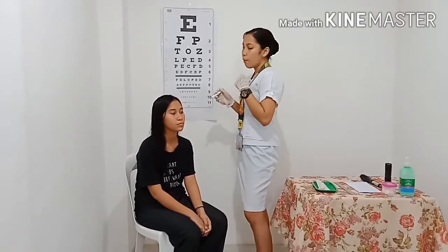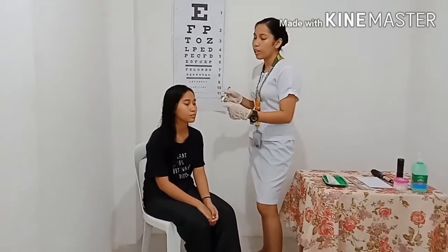The light should pass through the iris and the pupil, and there should be no shadow reflecting from the side of the pupil.